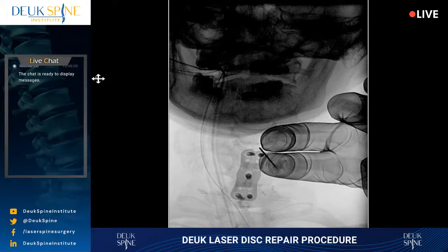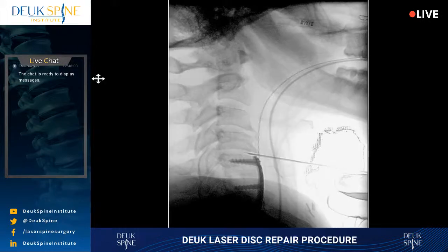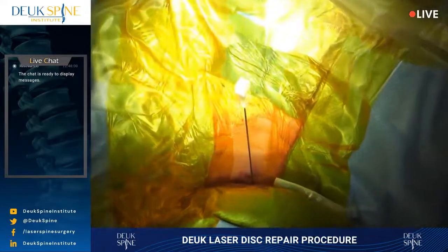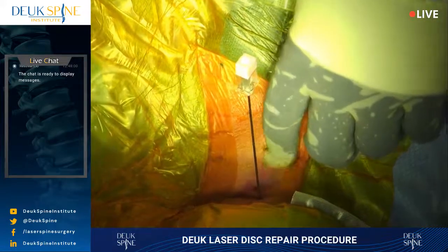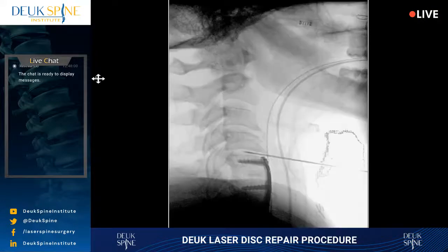So adjacent segment disease is tough because you have obviously the metal that the other surgeon put in. Now let's get an AP view. Now we got some time. So I had to press down, and right above her prior fusion, I could feel the actual plate with my fingers.